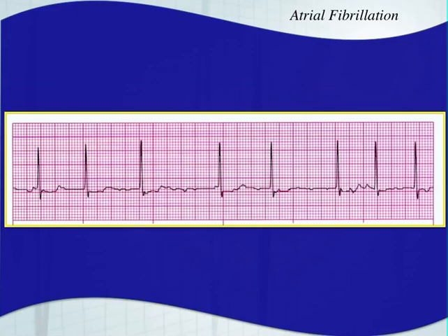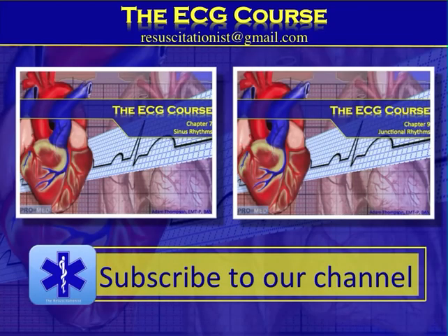Here's AFib again — this one's a little bit slower, about eight beats counted — that's very controlled. We don't have any clearly identified P waves, it's irregularly irregular and it's narrow — we have to call it AFib. That is it for this lesson. If you want to go back and look over sinus rhythms again, click on the left image and it'll take you back to chapter 7 on sinus rhythms. If you're ready to move on, chapter 9 is going to start talking about junctional rhythms.